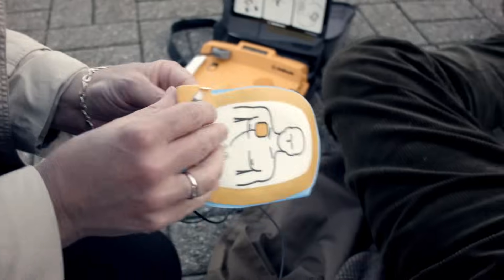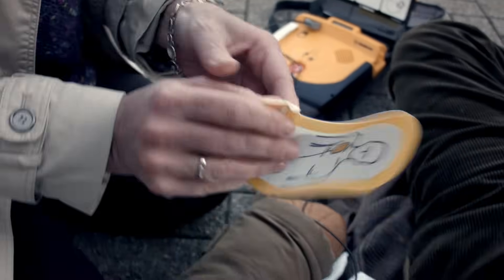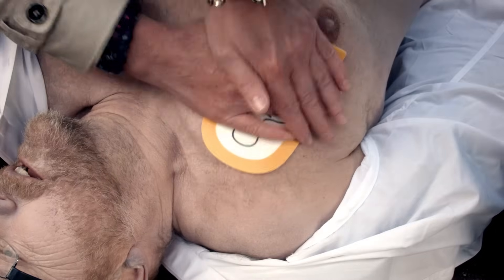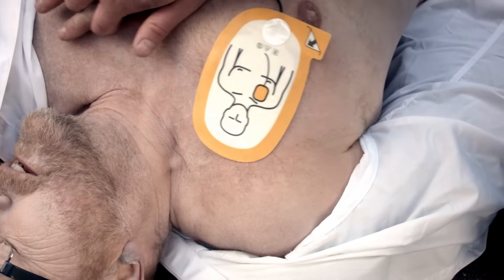Peel other pad off blue plastic. Apply pad to bare skin exactly as shown in the picture. Press firmly.